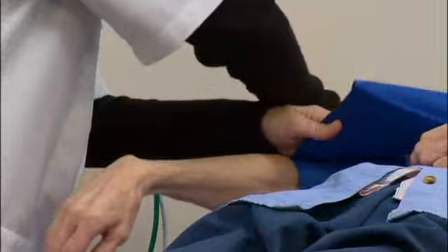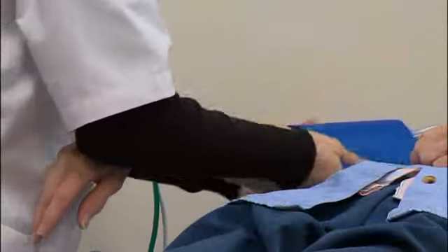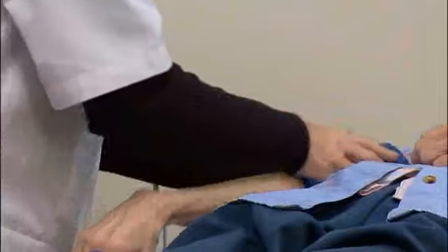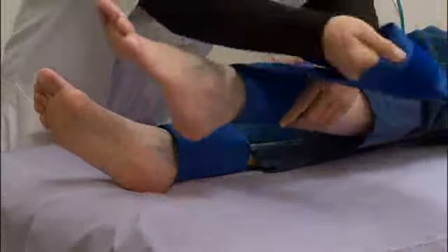Place the cuff as shown here for brachial pressure. Avoid rolling sleeves or pant cuffs in a manner that could obstruct blood flow. For the ankle pressure, wrap the cuff just above the malleolus.